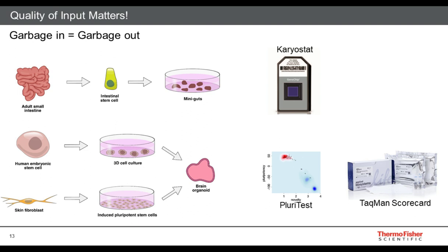But if you're working with stem cells, it is good to periodically characterize the chromosome number or chromosome abnormalities to get a sense for what the genomic stability of your system is, so that there aren't chromosomal abnormalities that may be contributing to aberrant differentiation methods, so that when someone else tries to use a given method on their own cell line, they get different information than what was published.